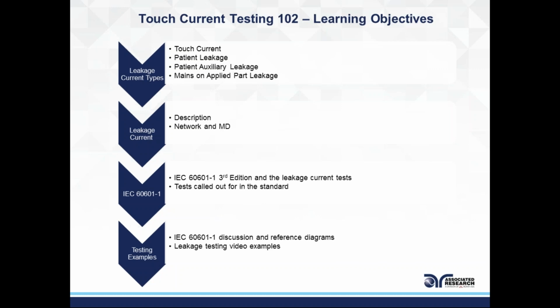There are other requirements to keep the product safe electrically. In the previous webinars, we also covered hipot tests and ground bond testers. These are all tests that are also required in addition to these touch current or leakage current tests. And the medical industry is one of the industries that do require these additional tests, because the applied parts are coming in direct contact with a human being.